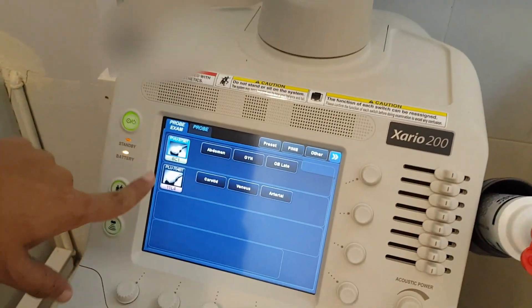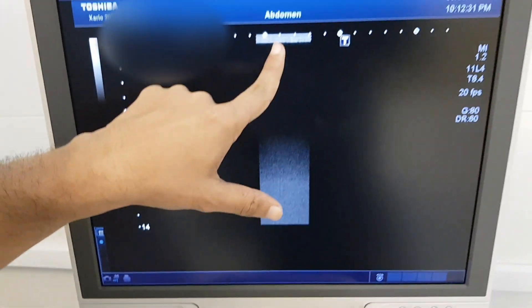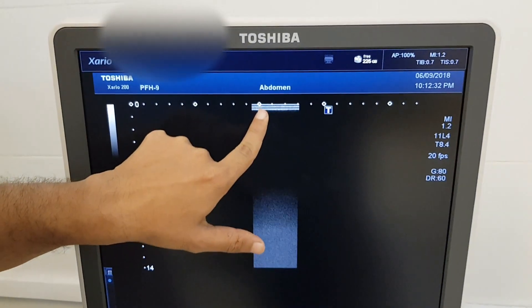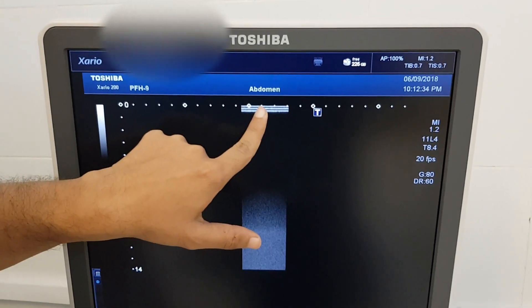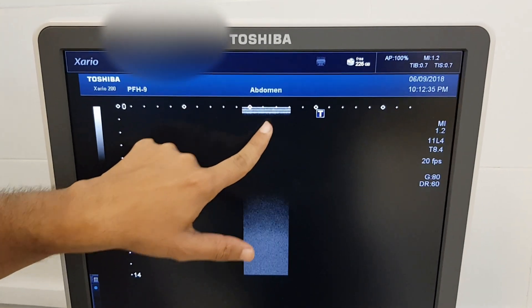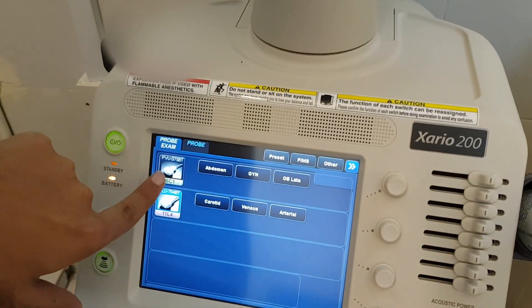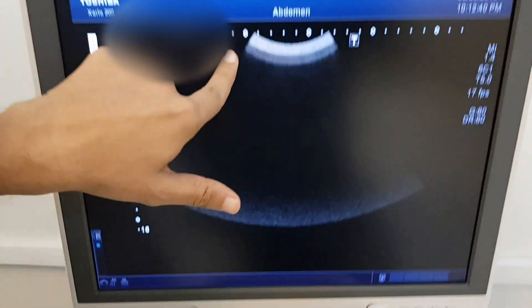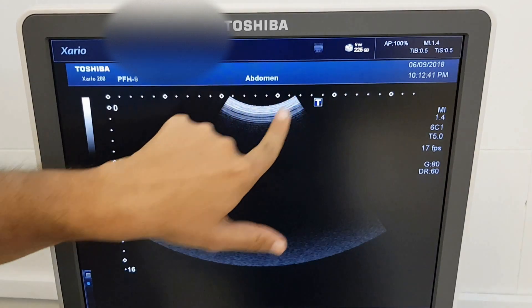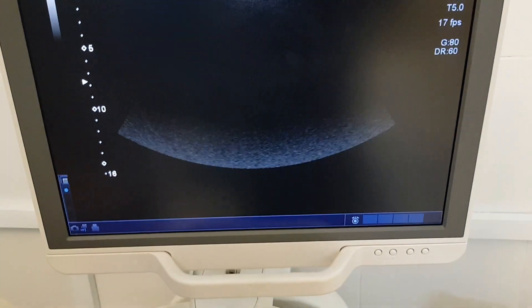Whatever probe you want to select, when you click it, it will be changed here. There will be a straight line, which means that it will be your linear probe selected. When we press it again, you will see that it is curved. This is probe selection.